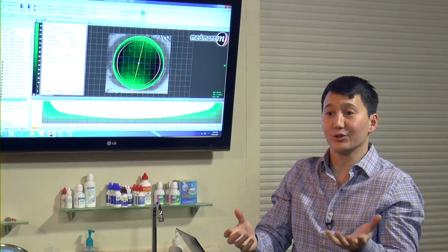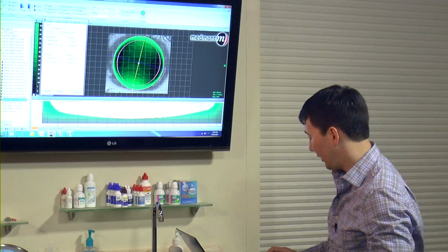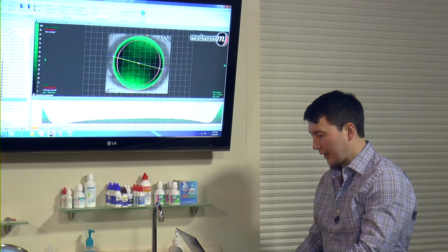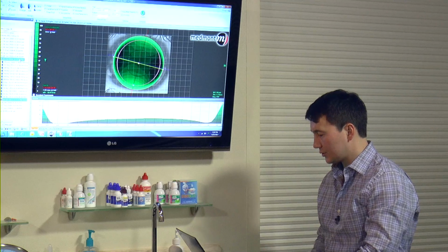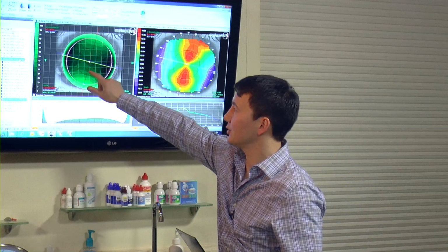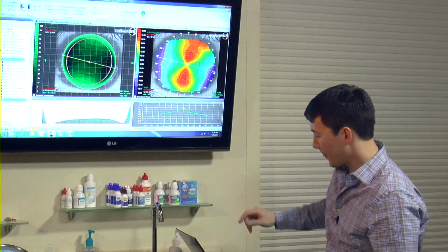And that's because we're putting a spherical lens on a 2.5 diopter corneal astigmat that also has limbus-to-limbus astigmatism. So this lens is going to be tough. We're going to have a tough time making a good go of this. Having the lens stable, having the lens comfortable for the patient, and maybe creating stable vision too, because if it's moving excessively, this optic zone junction may just keep kissing the pupil margin.